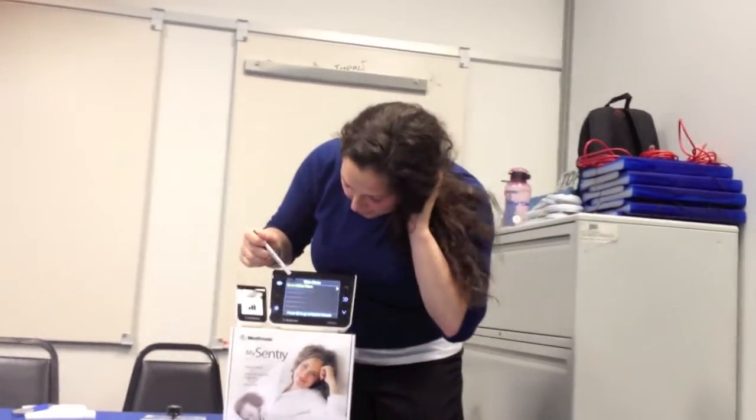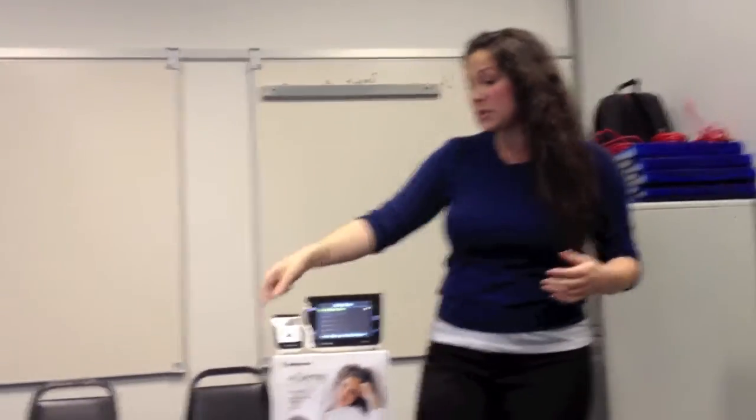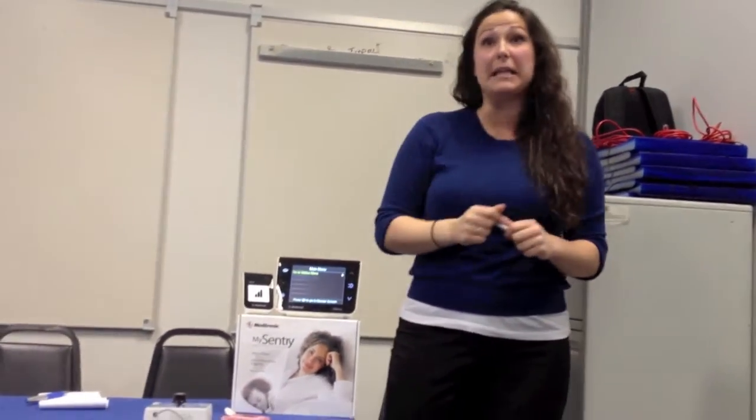So this is your main menu, which has your utilities and also an ability to view the network status. So you can actually view what's going on with the signal, and you can identify how the signal is going from my pump to my system, or how it's working from my outpost. Am I having any interference or any issues with my outpost, and how would I go through and identify that and isolate it, really?